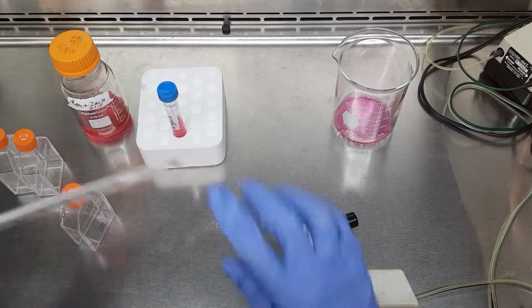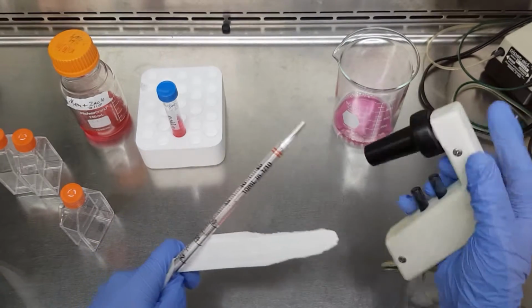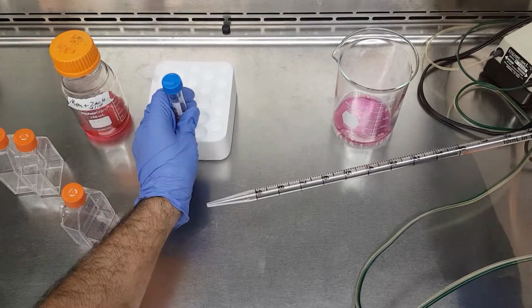Using a pipette, add 2 milliliters of trypsin to the flask, allowing contact to the cells for 10 to 30 seconds. Be careful not to pipette the trypsin directly onto the cells, as it could damage them.